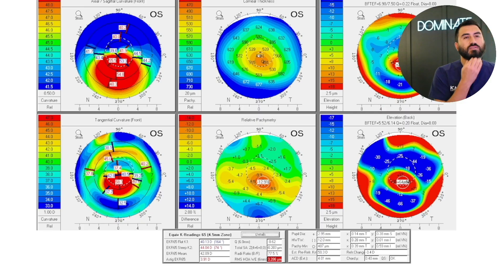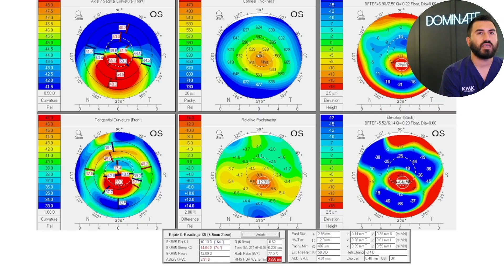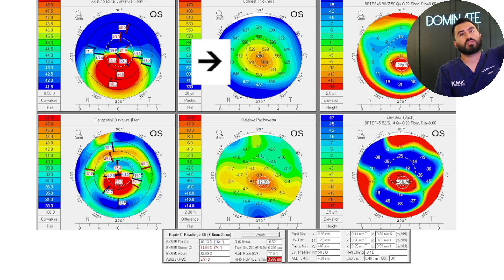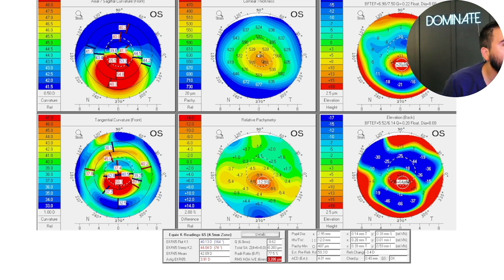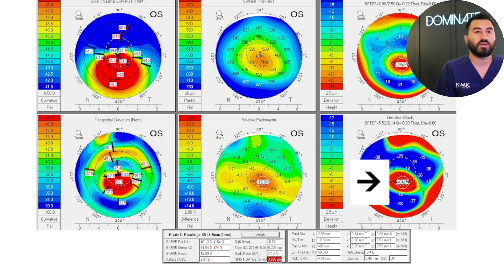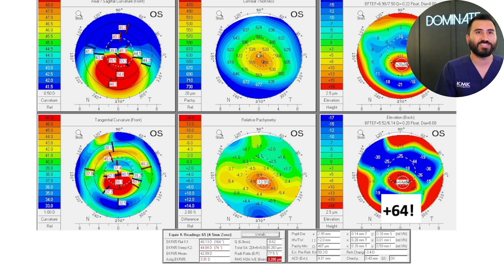So here, what do we got? This patient comes into your clinic. Inferior steepening, thinning of the cornea — inferior steepening, top left, top middle. You've got some thinning there, around 480-ish. Bottom right, posterior float. If it's above 15 we're thinking this might be some kind of posterior float, some kind of ectatic disease — and you'll see there plus 64. So that's keratoconus.